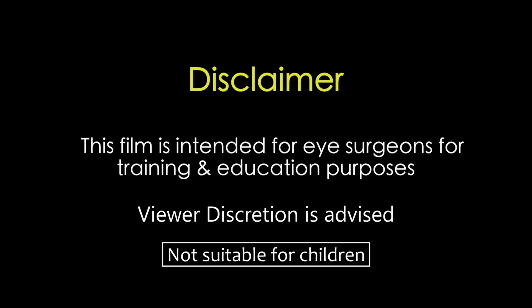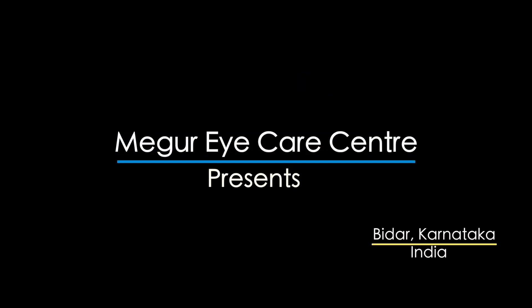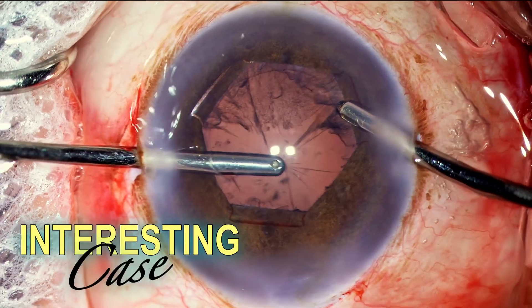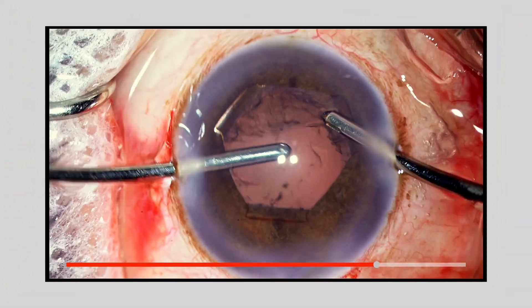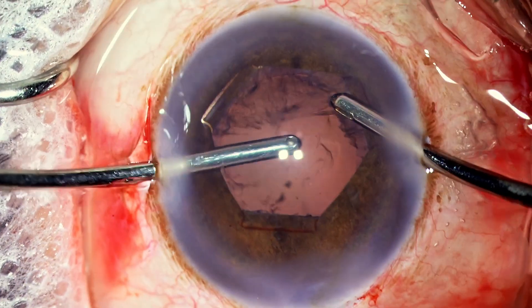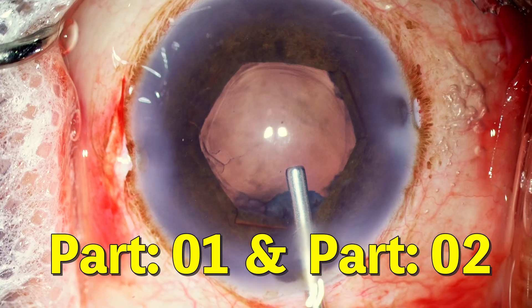This film is intended for eye surgeons for training and education purposes. Viewer discretion is strongly recommended. This is a very interesting case — quite a long case with a lot of things to learn and teach. I'll make it into two parts and let's see how things go.